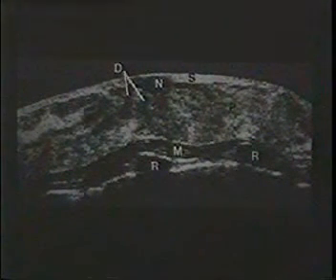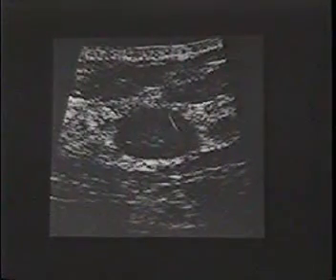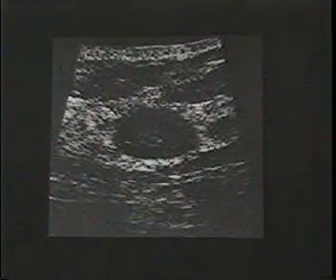In the fatty breast, it's more problematic with ultrasound because fat lobules can mimic lesions. And here's an example of the typical fat lobule in the breast that more than once has been biopsied when it was found on sonography in a woman who had a mammographic finding or maybe a questionable palpable finding. Usually we don't have too much trouble with this because of the typical echogenicity. It should match the subcutaneous fat. And usually if you scan along the margins, you'll find another lobule of fat adjacent to it.